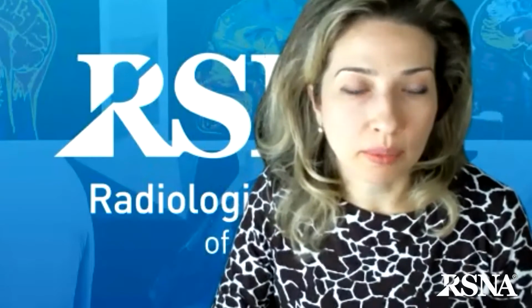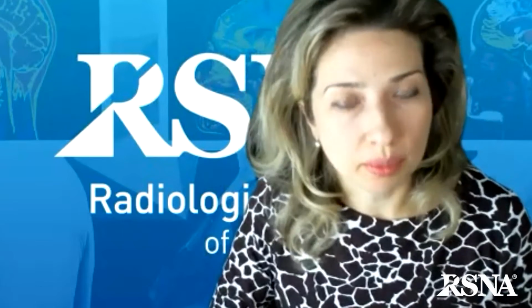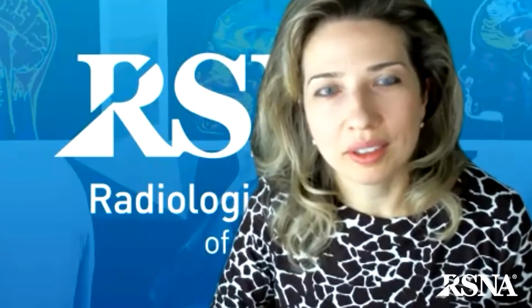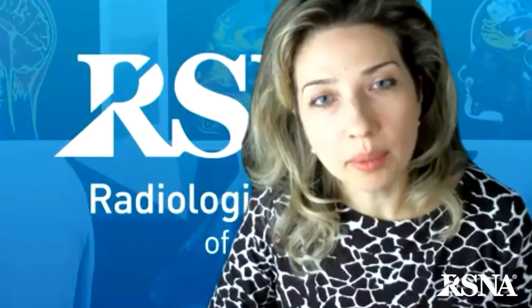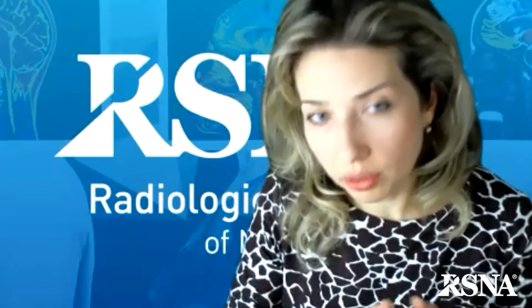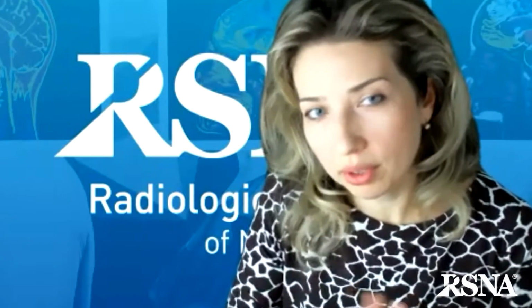This includes some general principles such as optimizing patients' comfort and positioning in the scanner. We're only as good as our least motion-degraded image, right? And optimizing coil selection, and also prescribing your imaging planes to the anatomy you're investigating, to prescribe them individually for the finger you're interested in, and often it helps to include the neighboring finger for internal comparison.